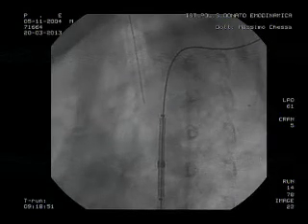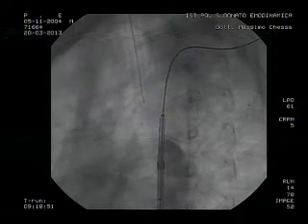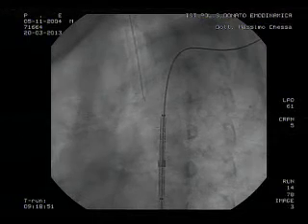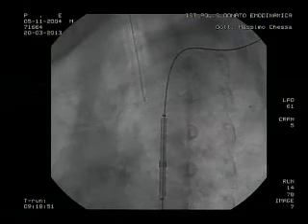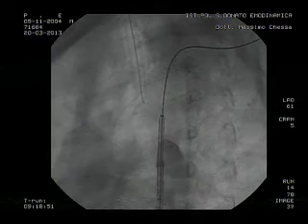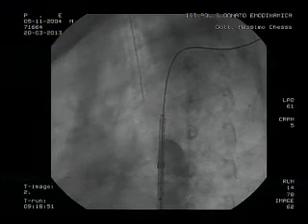The stent's going to get shorter, and I never use the left subclavian unless there's a real reason for doing that, because the problem here is that as he expands the balloon, even though the left subclavian is big, it may push him down, and then the stent will be too long. Too much of it will hang below. So either you can still slip the stent out and put it in the right subclavian, and then I think it'll give you more purchase to put the stent a little bit higher, and it won't milk down, and then it'll look much better.